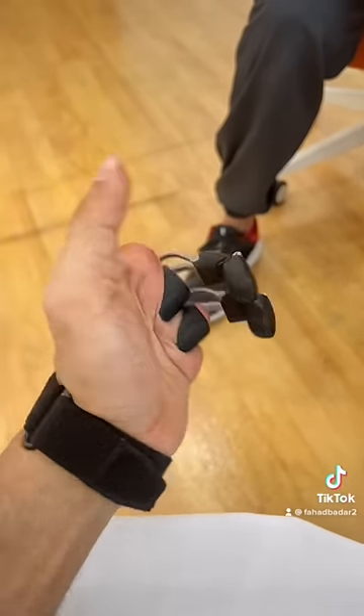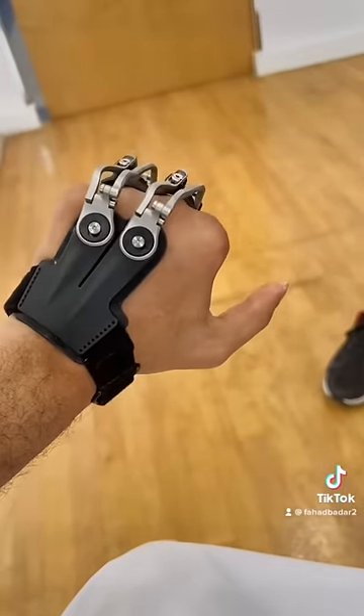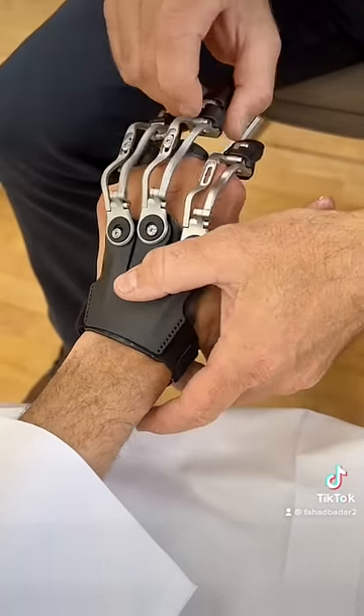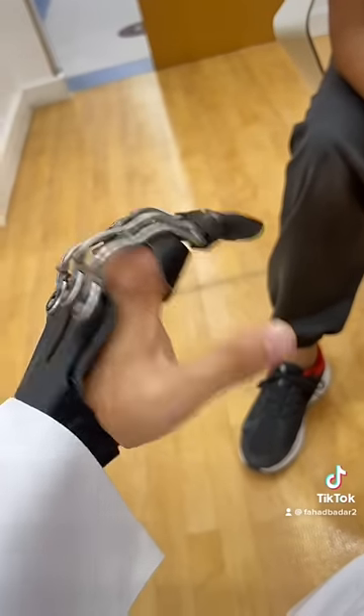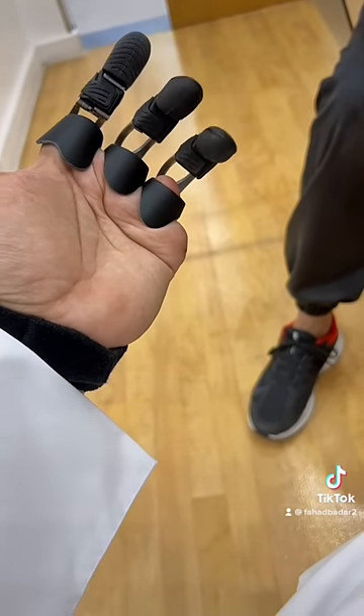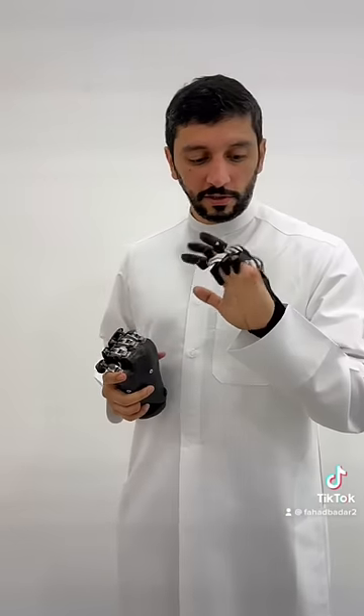So you see, now it's two. Now I have a dual. I can use this one now. The new ones are becoming more scary now.